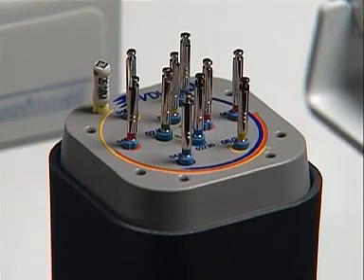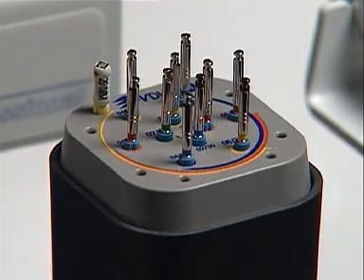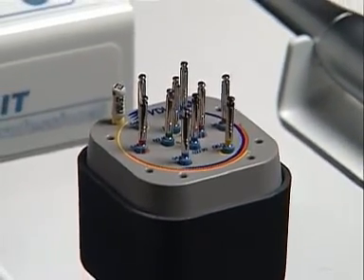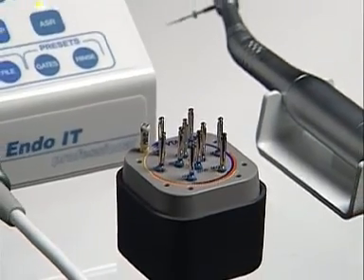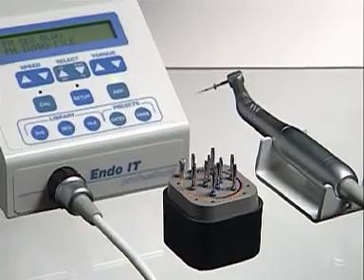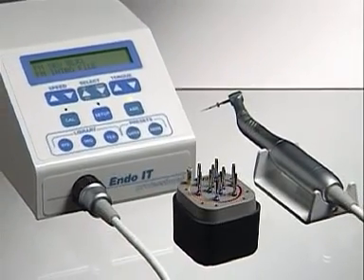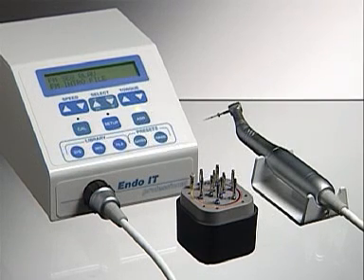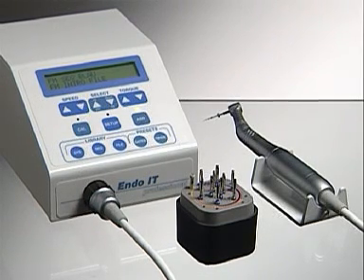In order to take full advantage of the nickel-titanium material and the effectiveness of the instrument design, and in order to avoid the unpleasant consequences of instrument fracture, the file must be used with the correct torque control setting specific for each instrument size and design. Equally as important is that the speed setting is correct for the file being used and that the speed is constant.